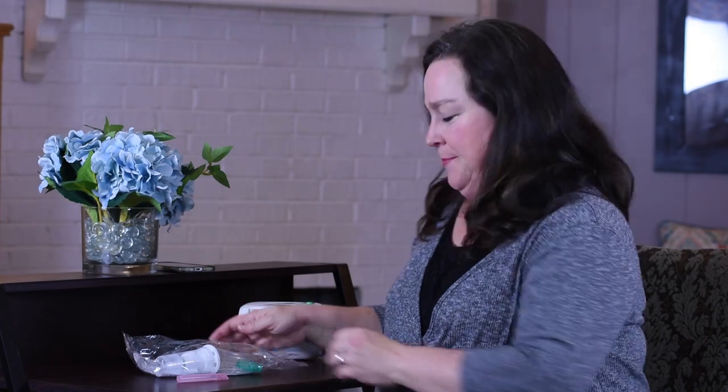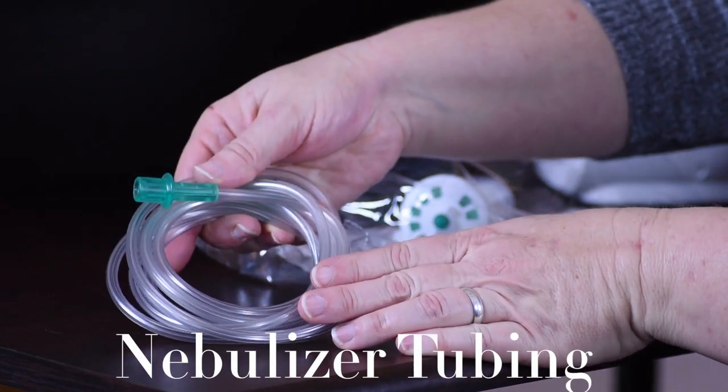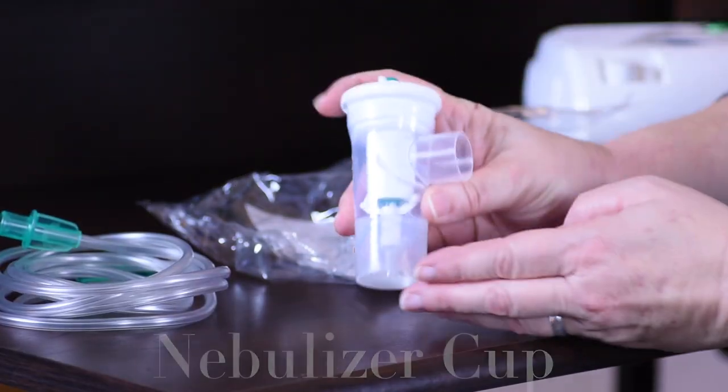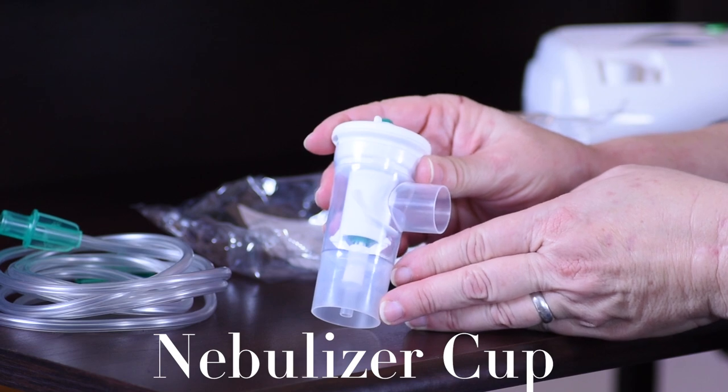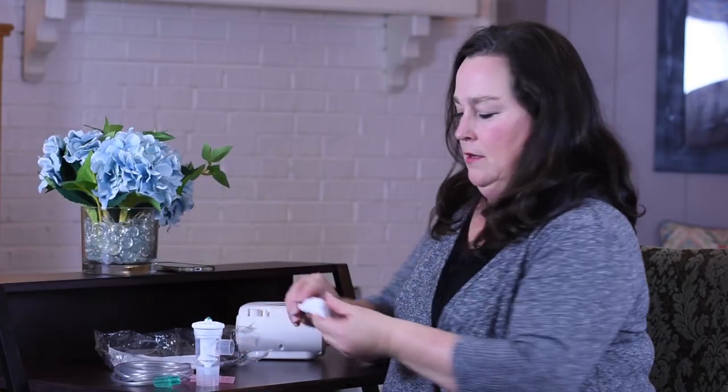Let's see what's in this bag: nebulizer tubing, the nebulizer cup, and the mouthpiece.